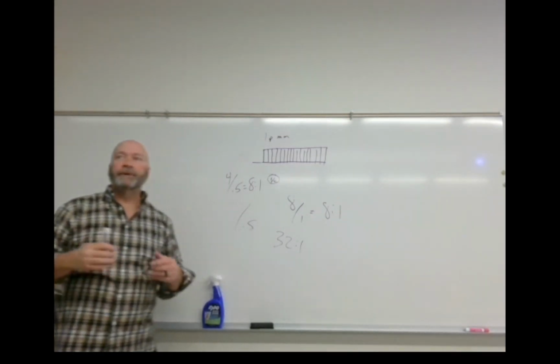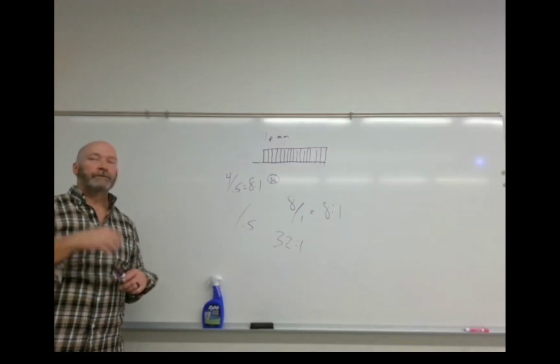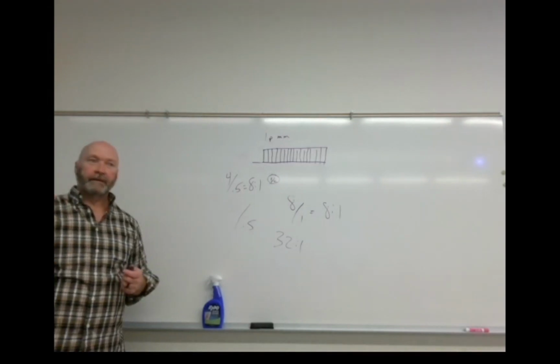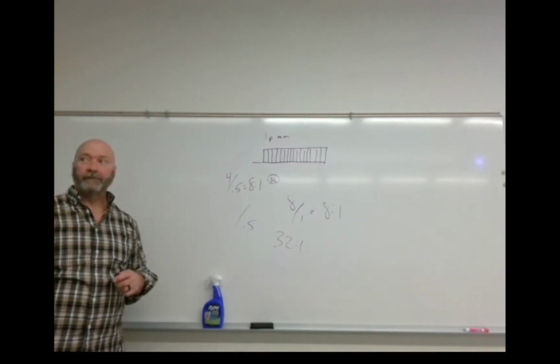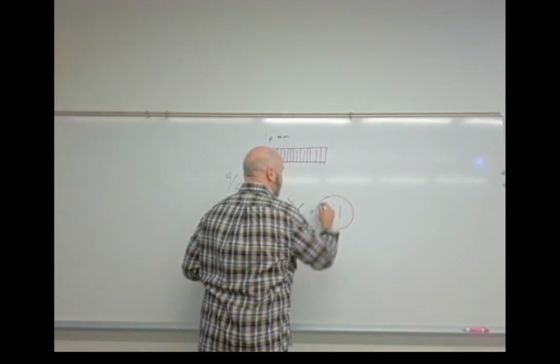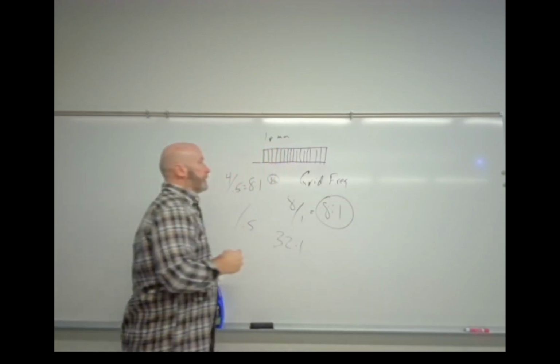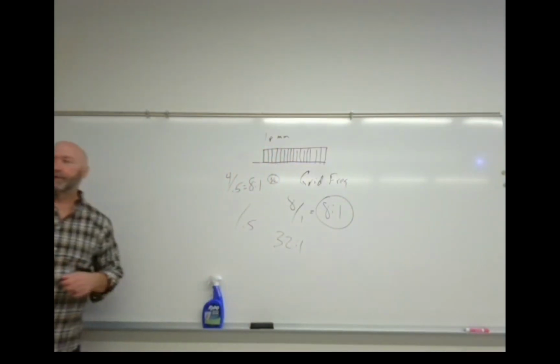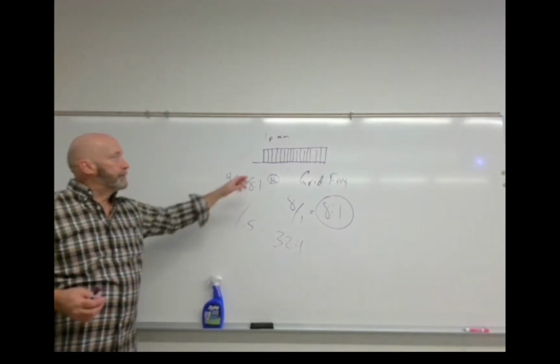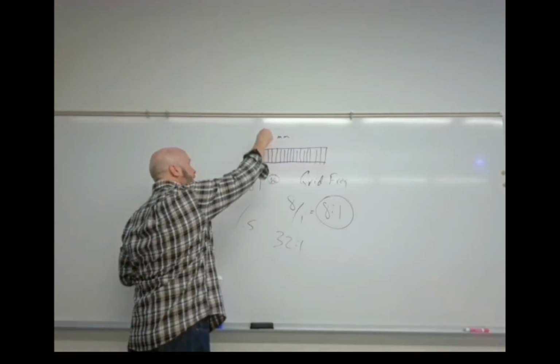So, when you do something very often, what do we refer to that as? There are different descriptors of electromagnetic radiation. You have wavelength and frequency, right? So this describes grid frequency. Grid ratio is this. Grid frequency is a measure of grid effectiveness, but it's not as good a measure as grid ratio is. Okay, so grid frequency just tells you how many grid strips you're gonna have in a given distance.